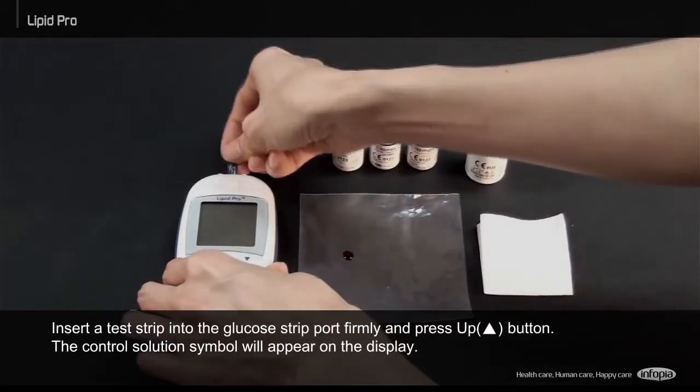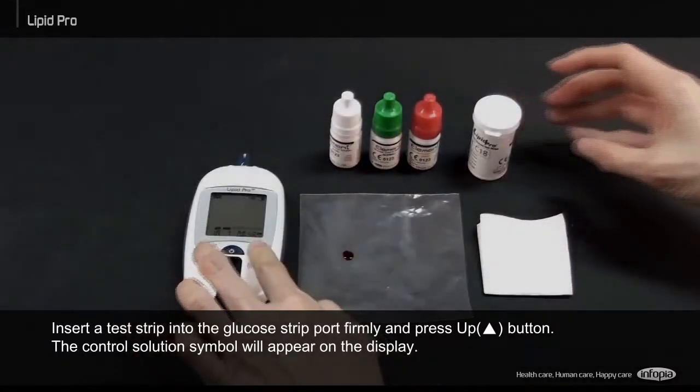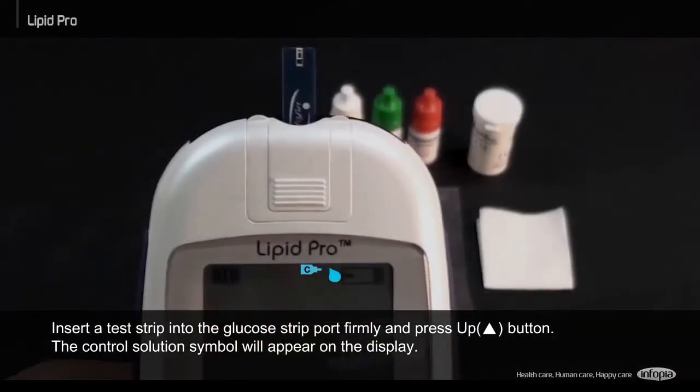Insert a test strip into the glucose strip port firmly and press up button. The control solution symbol will appear on the display.